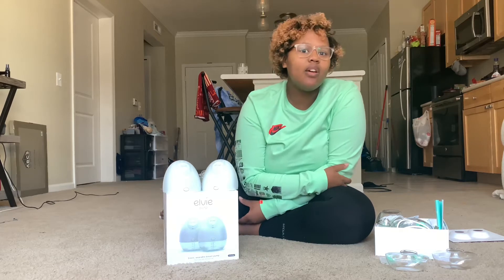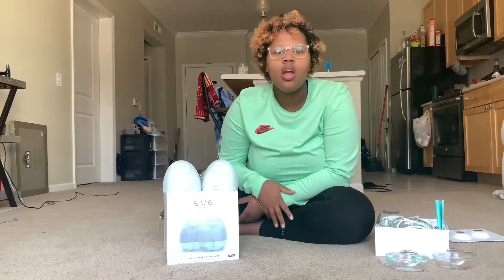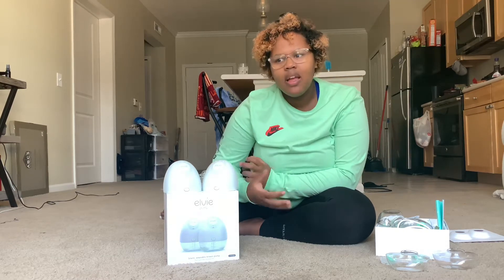Today I am giving a review on the Elvie pump, but before I start I just want to talk a little bit about my feeding experience and what me and Calicia do. Right now we are exclusively pumping because we're having some issues with latching and breastfeeding, so we're still meeting with lactation consultants and specialists figuring it all out.